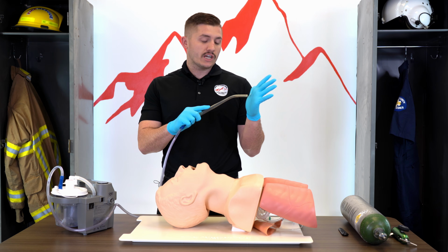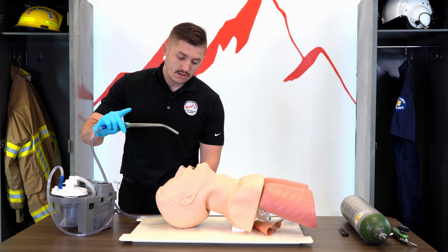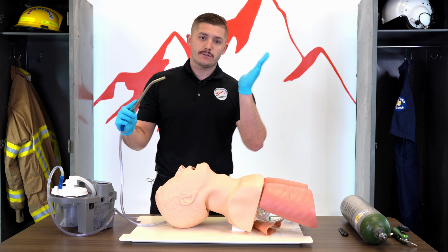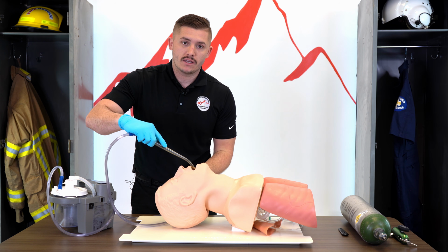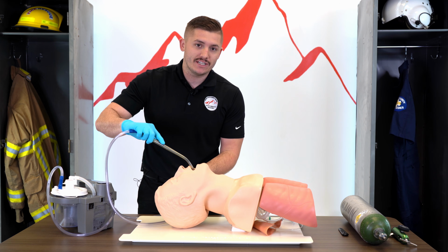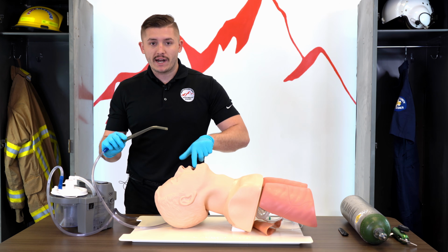So we want to test our suction, make sure we actually have suction. Then we're going to go into the airway without applying suction. If I go in applying suction, the tongue gets pretty floppy, or the cheeks might sink in a little bit, and I might catch the cheek, and I'm not actually giving suction. Or I might catch the tongue, and I'm not actually giving suction to the actual problem. That fluid is probably going to just sit right at the back of the throat.